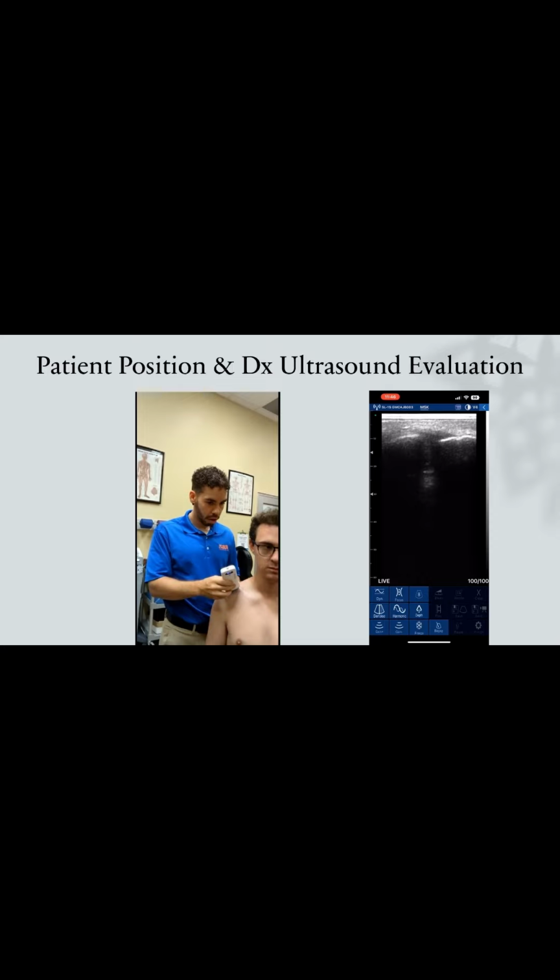The clinician will want to recognize normal smooth margins of both the clavicle and the acromion. You want to see uniform thickness and uniform echogenicity dorsal to the AC joint capsule. You want to make sure to sweep the probe posteriorly and anteriorly when doing so.